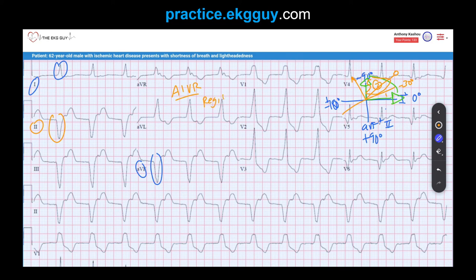The rate in AIVR is usually 40 to 100 beats per minute, though it can go up to 110. Anything above 100 leads us to start thinking of ventricular tachycardia. You may also see AV dissociation and capture or fusion beats, which are common due to competition between the sinus node and the ectopic ventricular rhythm that may coexist.